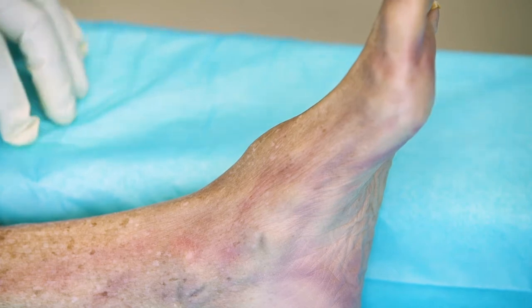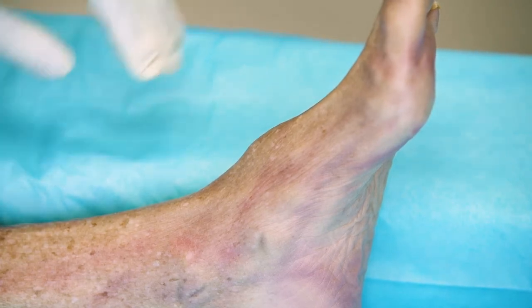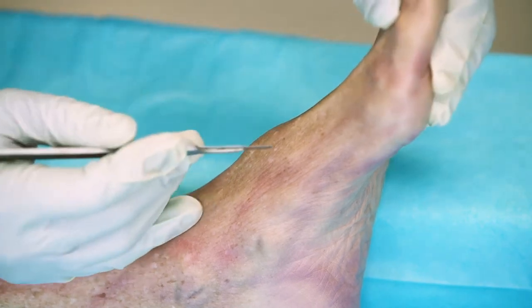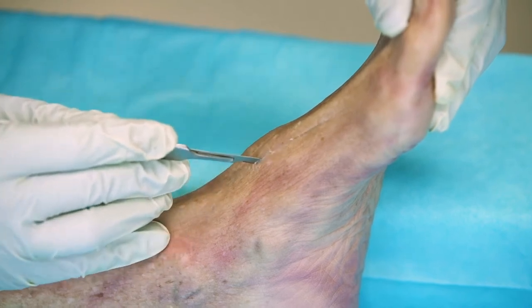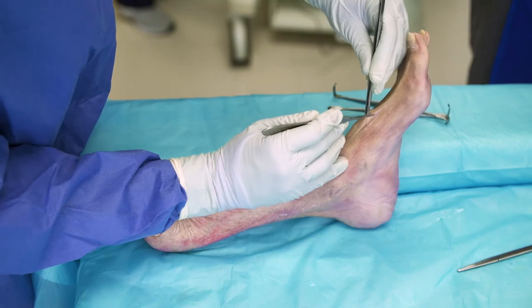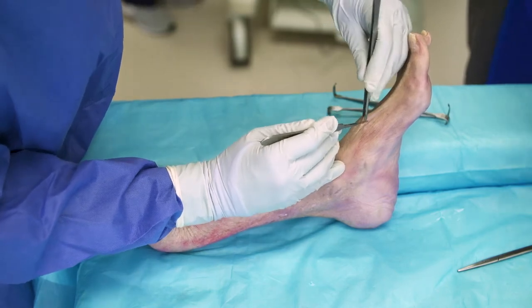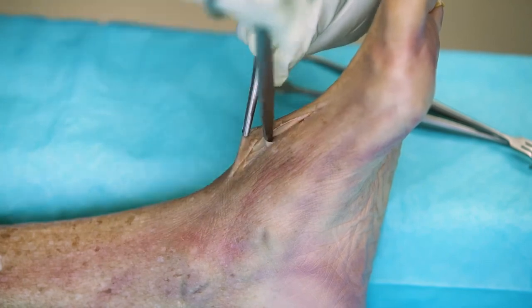To begin, I prefer a dorsomedial approach, sort of in between the EHL and tibialis anterior, certainly cheating towards the extensor hallucis longus. The first move is to find the extensor hallucis longus tendon to protect it.